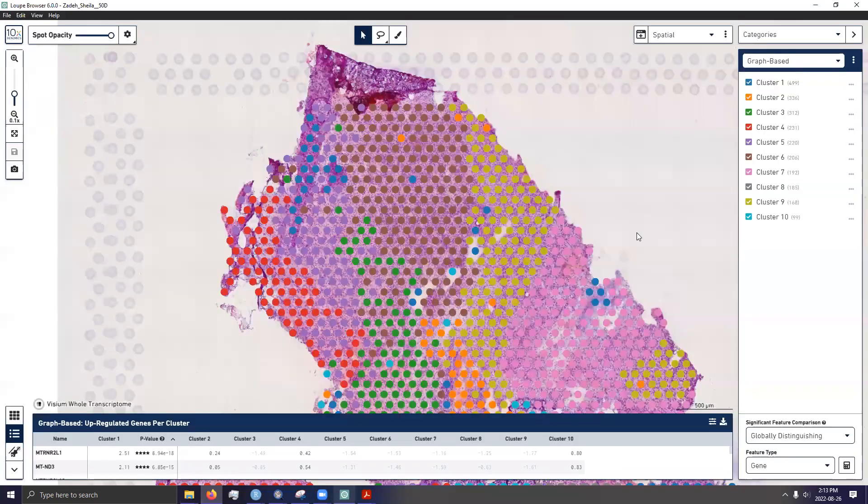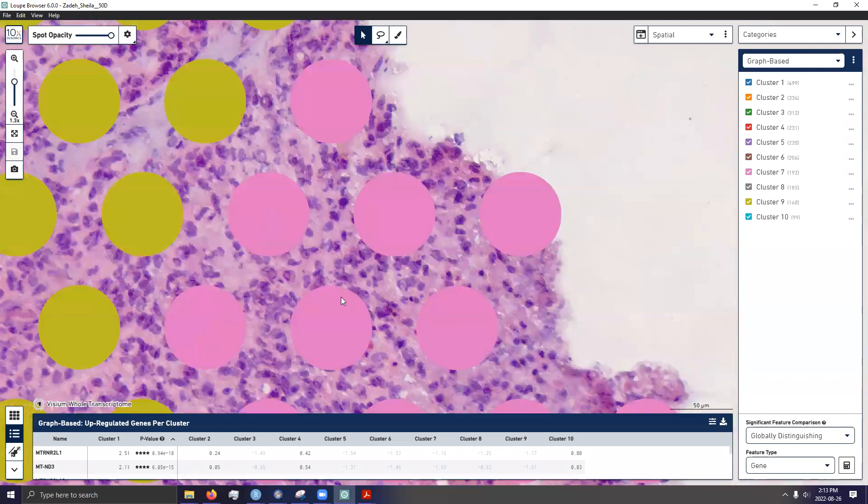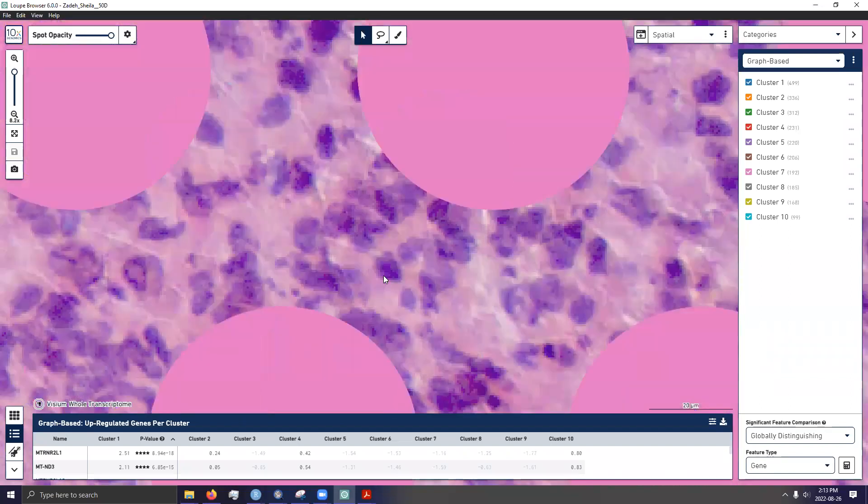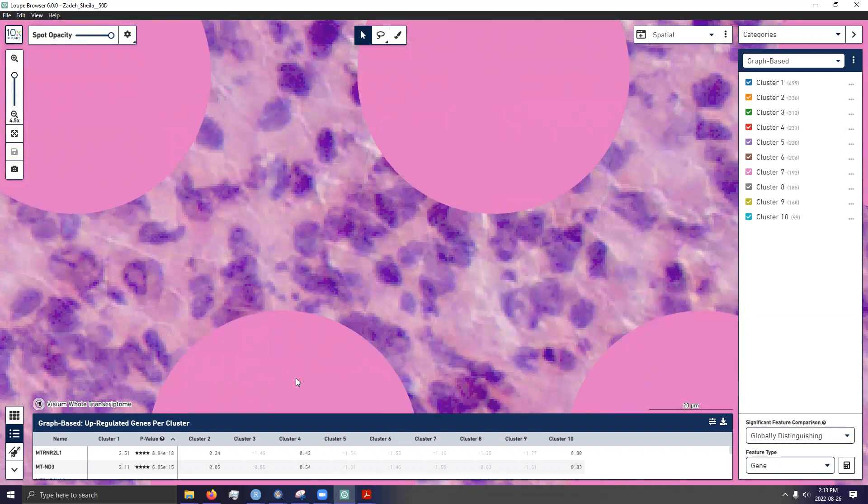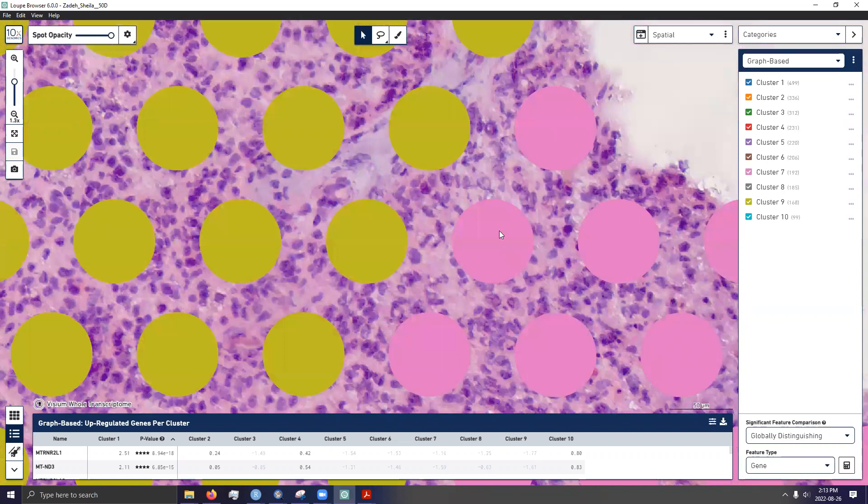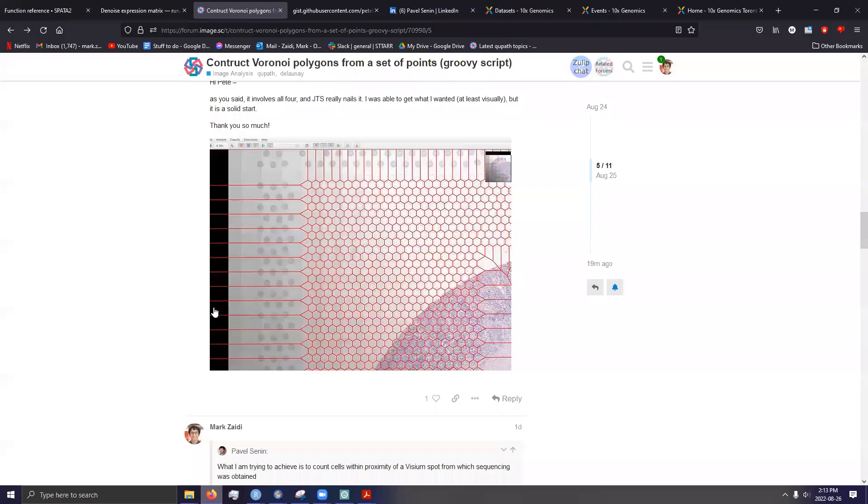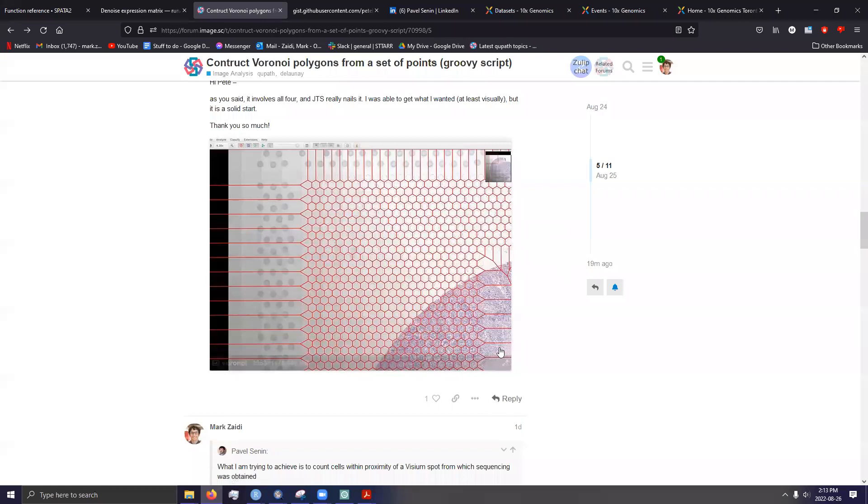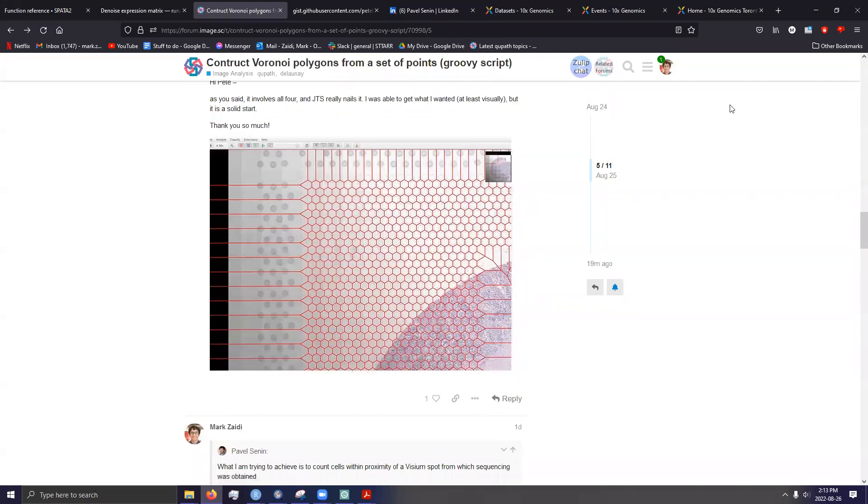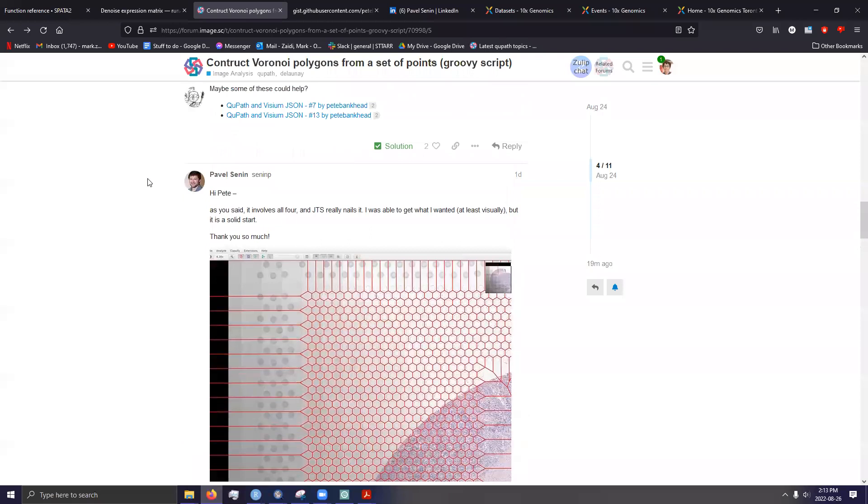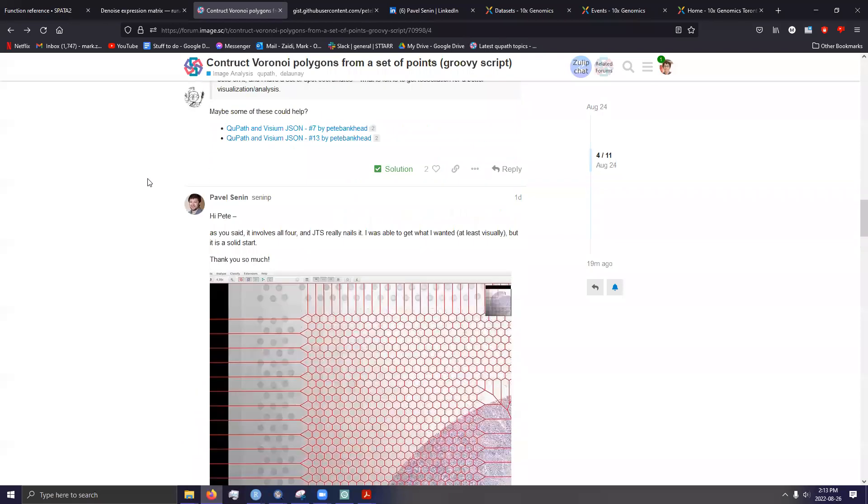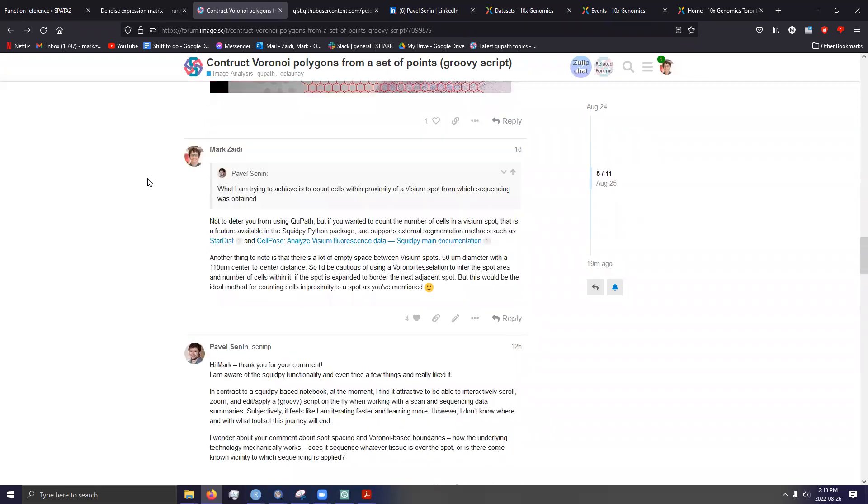So that's actually why I was kind of surprised with the use of Voronoi boundaries, because you can't really assume that spots are pressed up against one another, and then all cells will directly incorporate their transcriptomic information to one spot or another. Very well, if you have a cell that just, I don't know, lies in between the two, like this one, is it going to end up in this spot or this spot or neither? We have no way of knowing. I mean, not no way of knowing, but no way that I'm not intending to spend weeks or even months trying to answer.